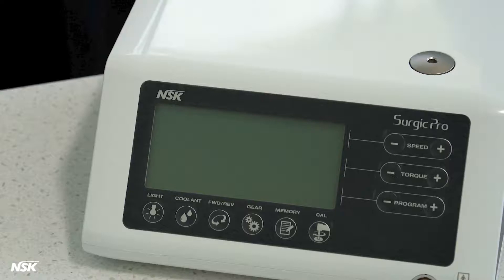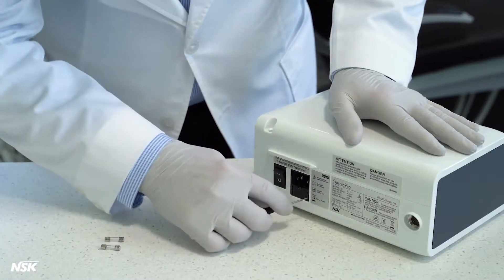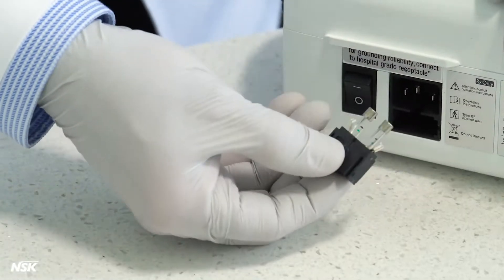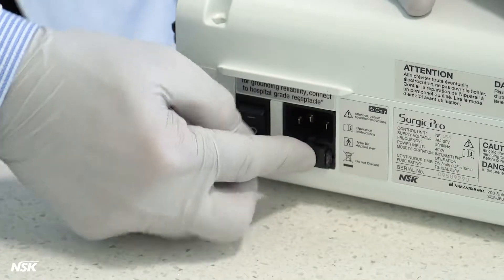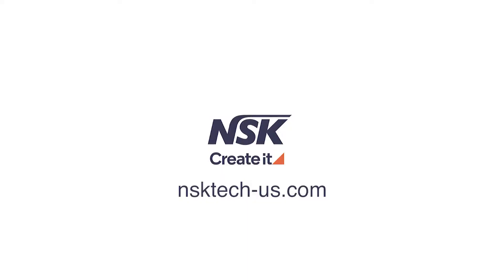In an unlikely event that the control unit does not turn on despite being connected to power properly, check the fuses. To access the fuses, use a pointed tool, push on the fuse locking latch, and the drawer will spring open. A spare set of fuses is included in the original package. Replace the new fuses in the box and put it back in its location. If you have any further questions, please visit our support site at nsktech-us.com.